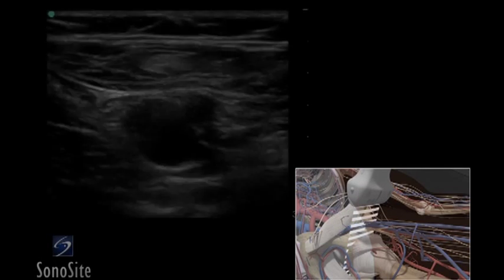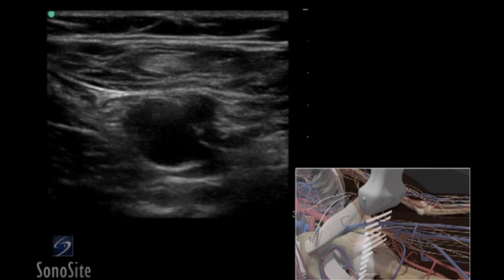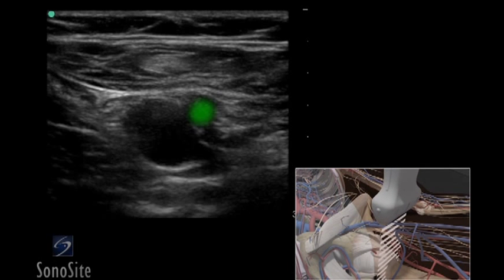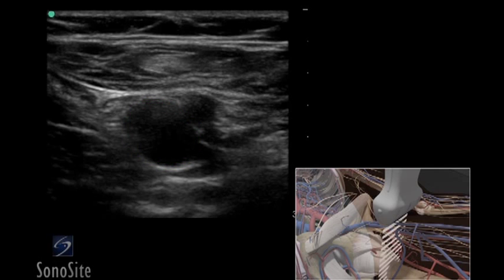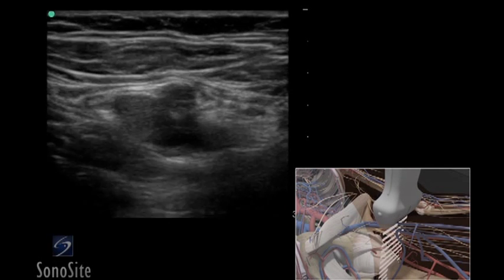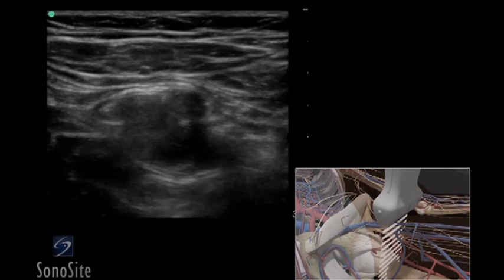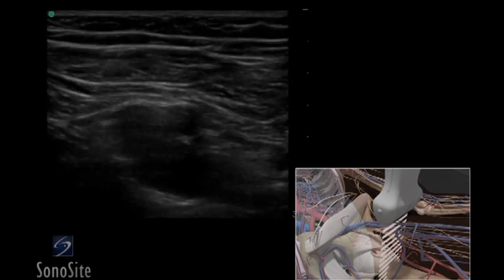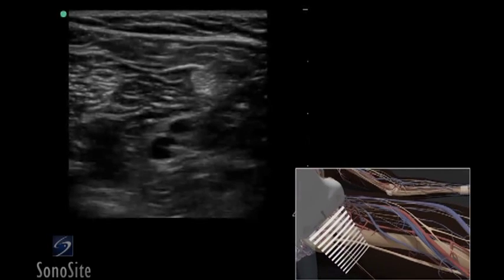Slide the transducer distally to the level of the confluence of the superficial femoral and proximal deep femoral veins. Repeat the compression technique demonstrating complete collapse of the veins. Move the transducer to the popliteal fossa.